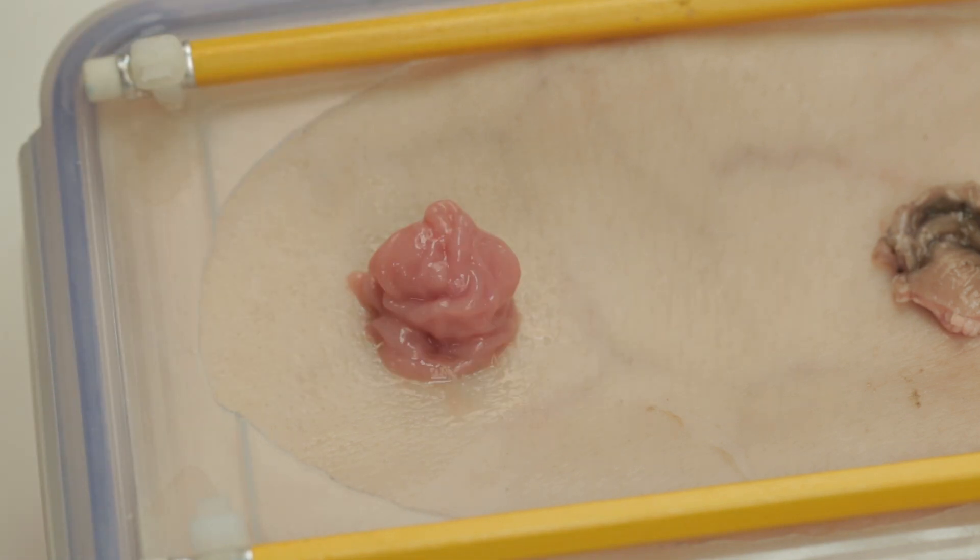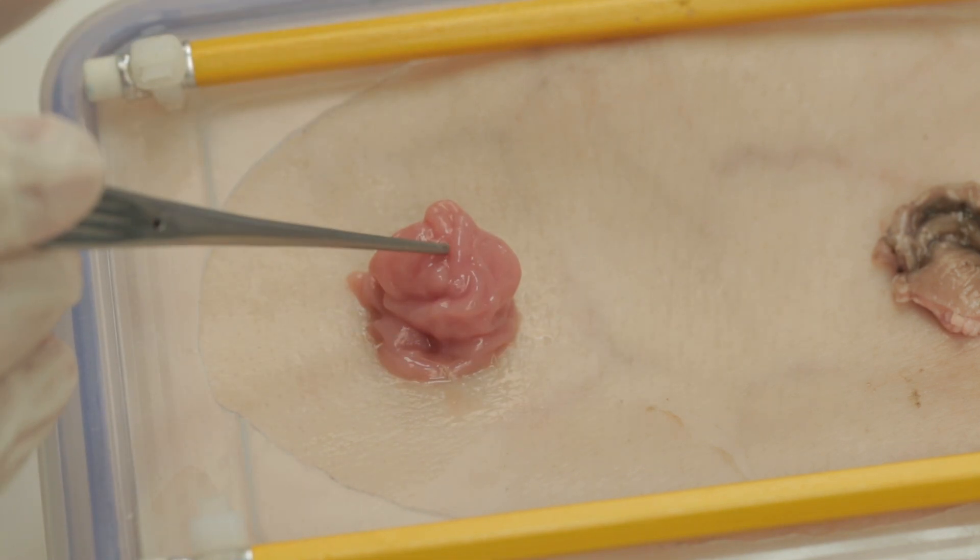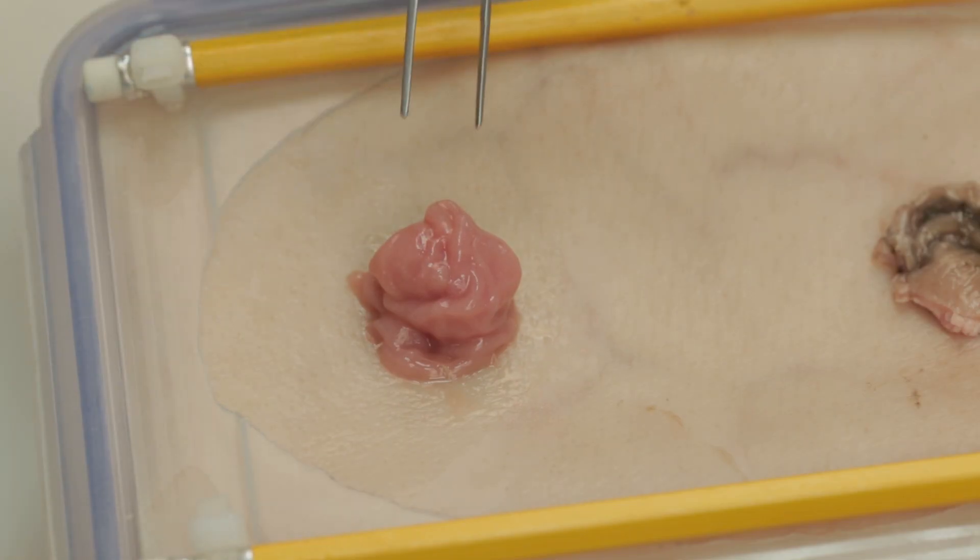Once all sutures are in place, check for gaps between them to make sure the stoma is adequately secured.